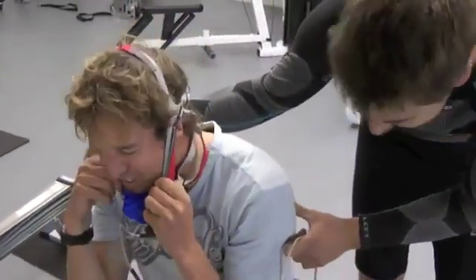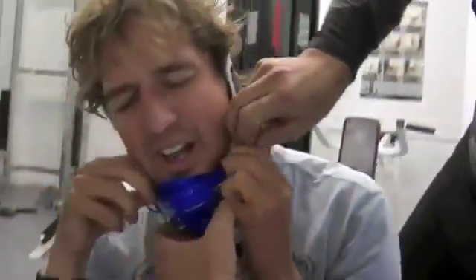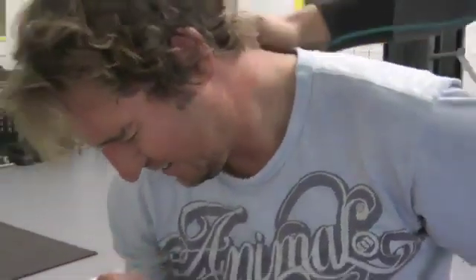I can't breathe with this thing. How was that, Simon? It's quite a restrictive one, the breathing. Having that on, you're very dizzy. Okay, keep moving your legs, keep sliding back and forth. That was well done. Well done, mate.